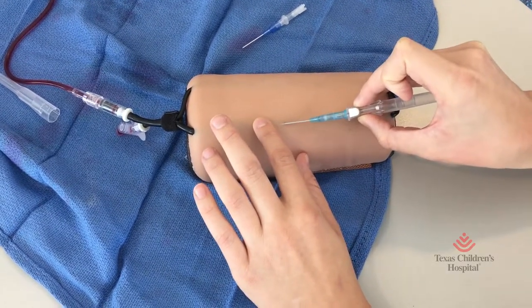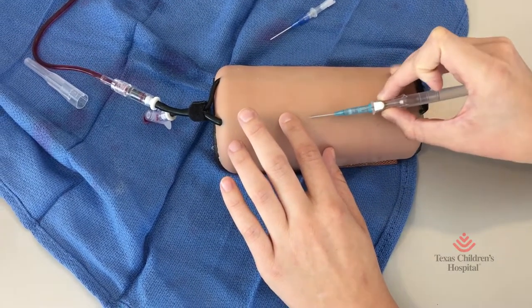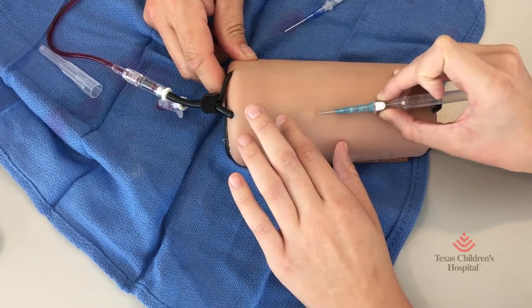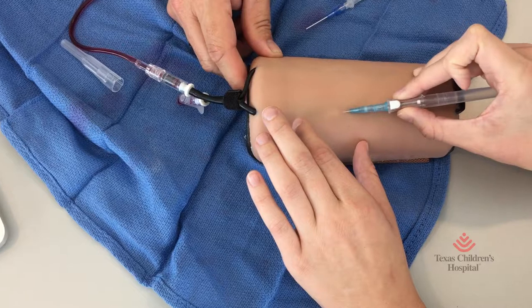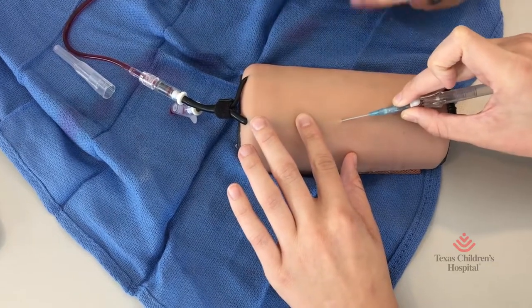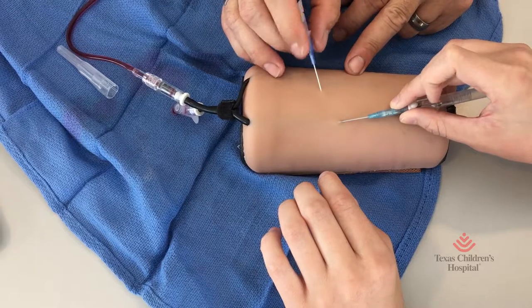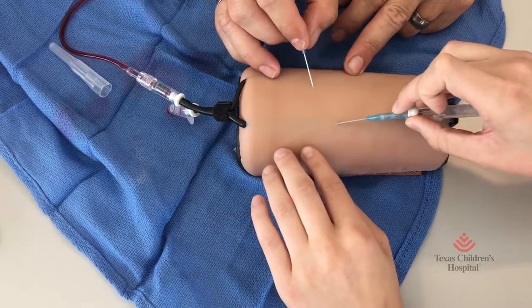Stick it like you would a butterfly — you want blood. You feel that? Now draw confidently. Get that vein. When you were sticking not for the vein, you were going like this. I want you to do more of a stab. You can see this is coming out slowly — so I'm in.